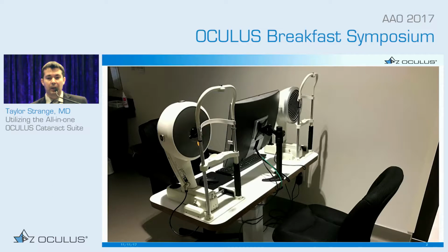And just like Dr. Wiley alluded to, this really speeds up my flow for how I work up my cataract and refractive patients in my clinic. It's kind of a one-stop shop to get a lot of information prior to your technicians dilating the patients. I get a lot of information that I can use in preparing for treatment of our cataract patients.